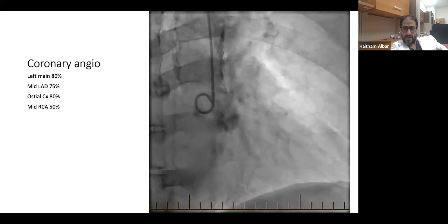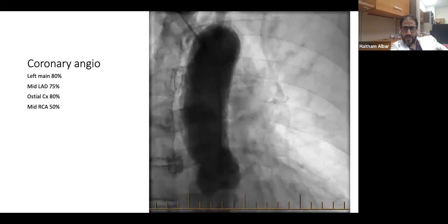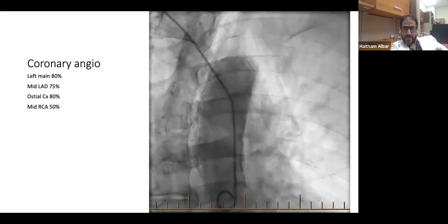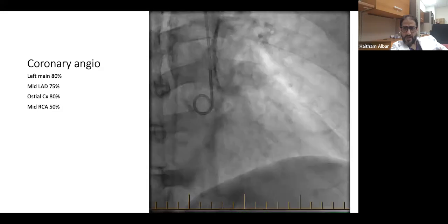No sign of, you can say, calcification from this shot, and it seems he comments that I need a full coronary angiogram.